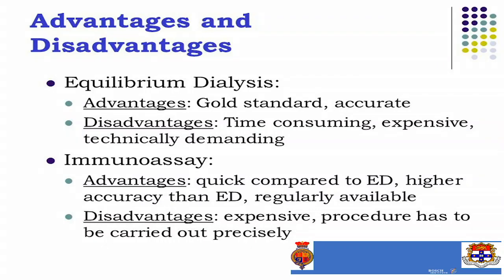And I think Anne McCormack was very, very quick in Australia to raise the problem where the HPLC assay for urinary free cortisol was brought out and said, here we have a wonderful assay, we're going to be able to measure free cortisol for the first time. And she said, yeah, but it doesn't correlate with what the patient's doing. And I think that's the sort of feedback we have to have. Instead of going right back to basics, I think we have to try and use our clinical associations, bring back the doctor and the relationship into the laboratory, which we've started to lose.